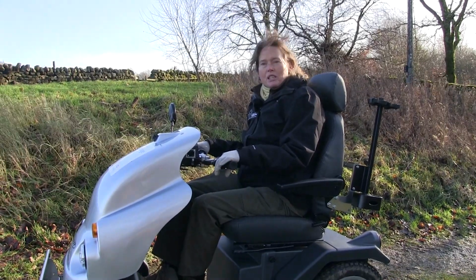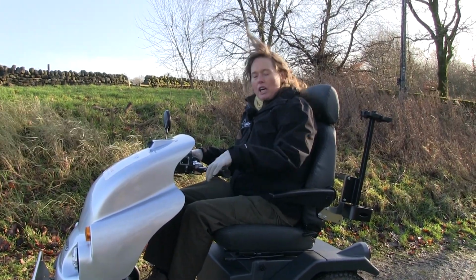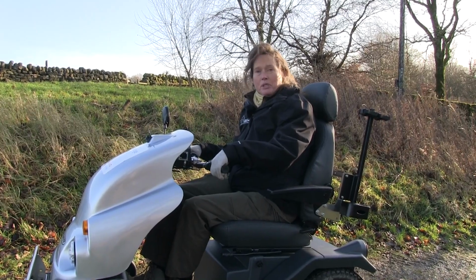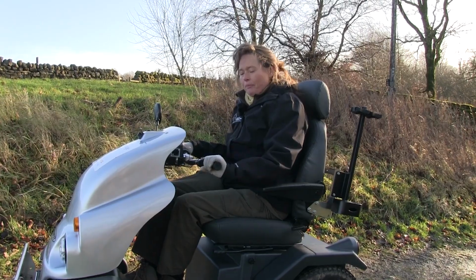So when you're starting on a hill, you need to be more confident using the throttle, and you need to pull it towards you quickly and keep it in position, and then you will move forward and you won't roll backwards.